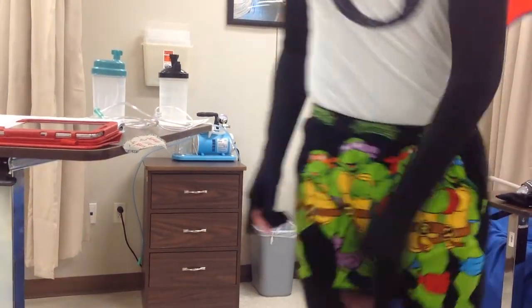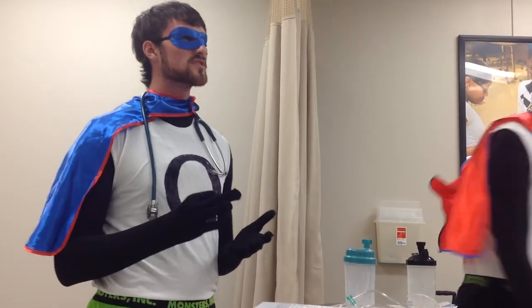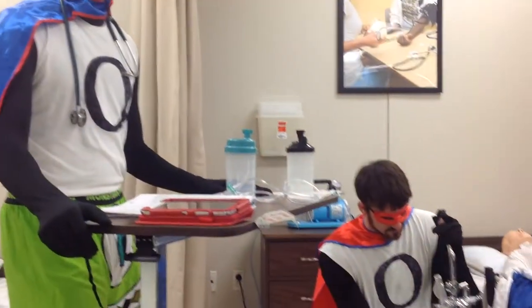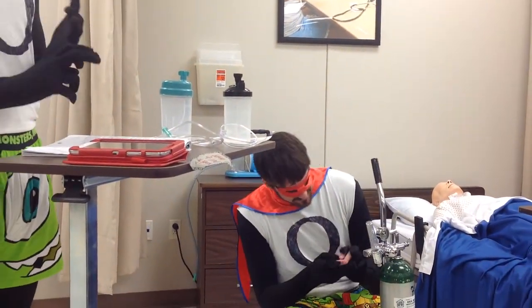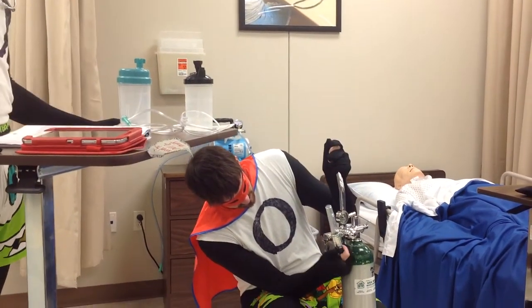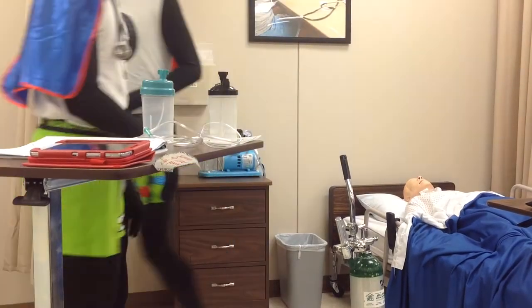Like I said, oxygen is a medication, so you'll need to do your 5 rights and 3 checks just like you would with any other medication. Once you have your oxygen prepared, you'll also need supplies, because you'll need to check vital signs and do a respiratory assessment. So you'll need your blood pressure cuff, a stethoscope, and things for a basic assessment. Once you have all your supplies, you'll be ready to go to your patient's room.